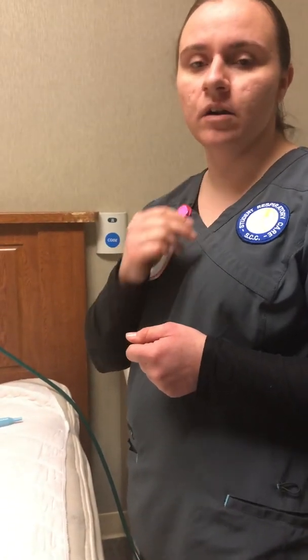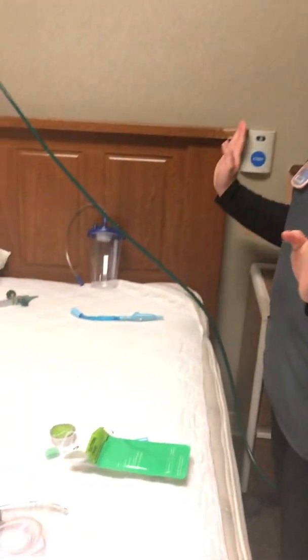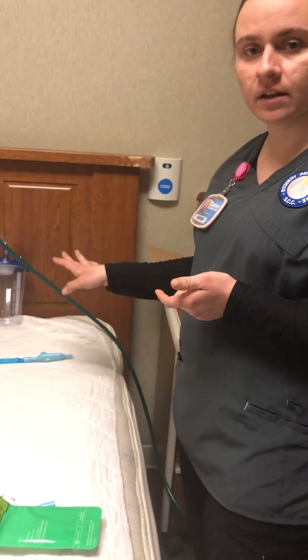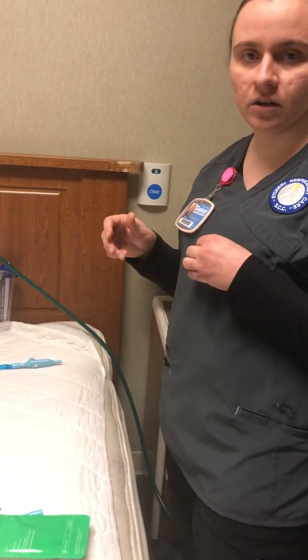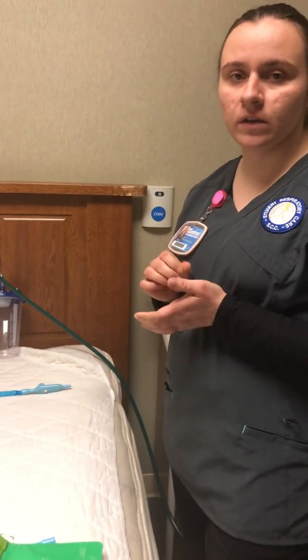And always, after you're done doing anything like that, you always want to listen to make sure you don't hear any leaking sounds, and make sure that it's not too tight, so that you don't get any sores inside the patient or any irritation. So when you're all done, make sure everything that needs to be disposed of is disposed of. You're going to reassess the patient, listen to the patient's lung sounds, check the vital signs, make sure everything's still okay, and always check to make sure the settings on your machine are at the right settings for that patient, and then chart everything in the patient's chart.